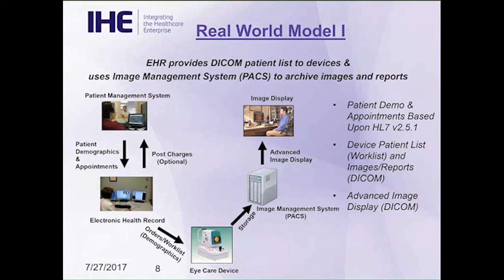So real-world model 1 is very important when the EHR takes the lead of the DICOM modality work list and you choose to have an image management PACS system as part of your clinic. Let's take a look at real-world model 2.